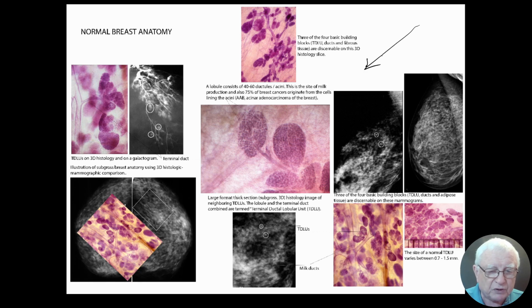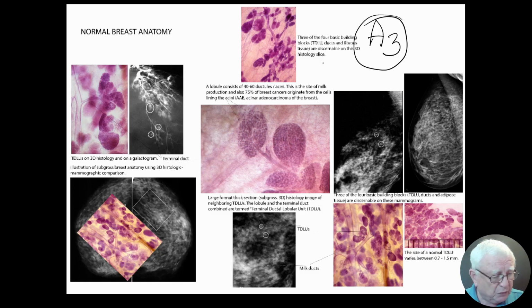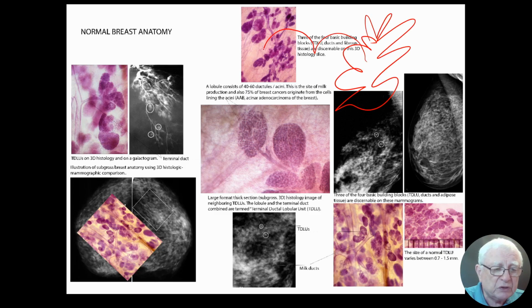A personal present from me, this chart. I would recommend for you that you ask somebody or you yourself print it on a large format paper, A3. And why not laminate it? So you have this in front of you when you're screening. We have the tool scientifically proven.